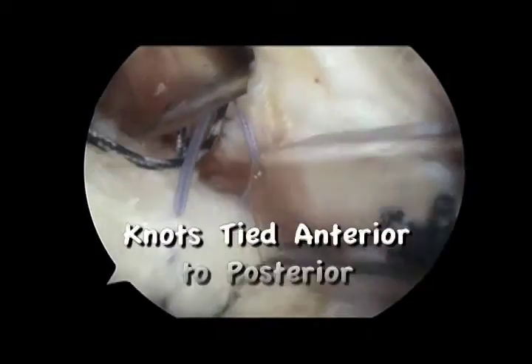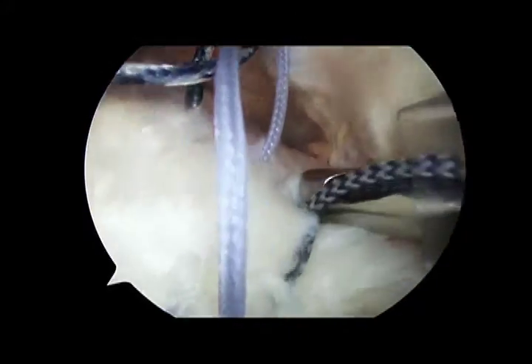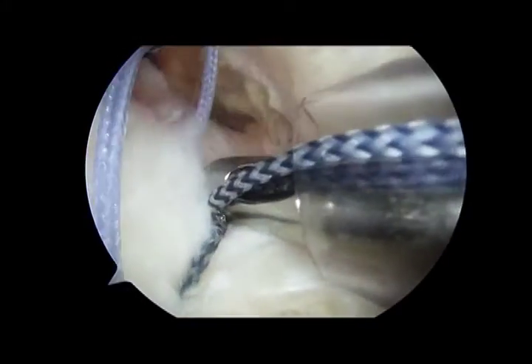We begin tying our knots from anterior to posterior. Using the suture passed through the cuff as our post, we tie a sliding locking SMC knot and reduce the cuff to the bone by repeatedly pulling the slack from the knot and retightening with our knot pusher.